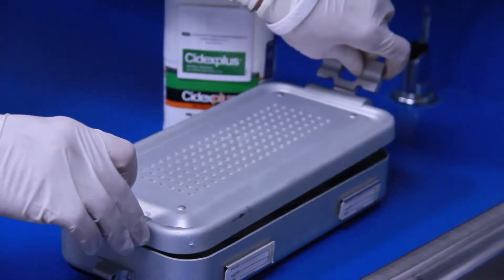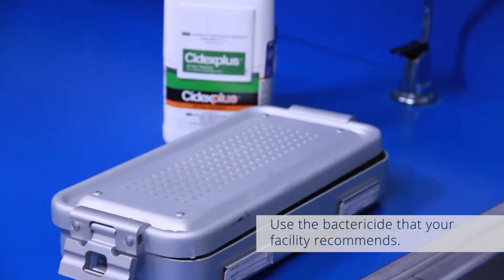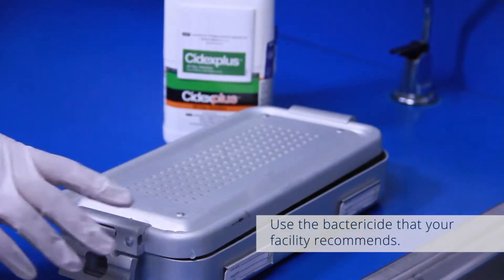If disinfection is all that is required and not sterilization, a 10 to 90 minute soak in Cydex may be all that is necessary.